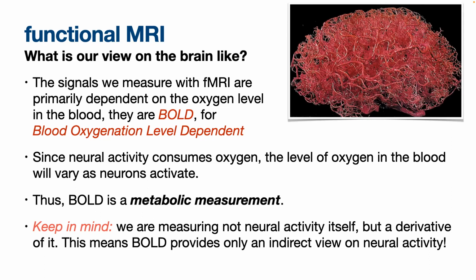Right? So caveat number one: fMRI may produce these beautiful images of a living human brain. And it's good because living brains have blood flow and all of that. But you are looking at blood, right? It's an indirect measurement of the thing that you're interested in. And you always have to keep it in mind, because it could be something completely different than what you think it is because of this.